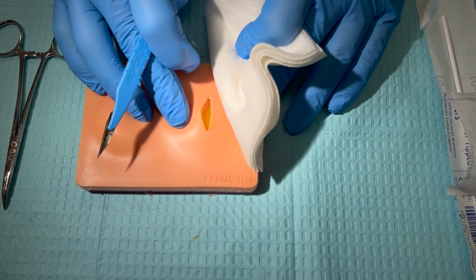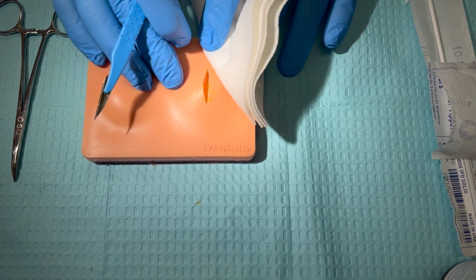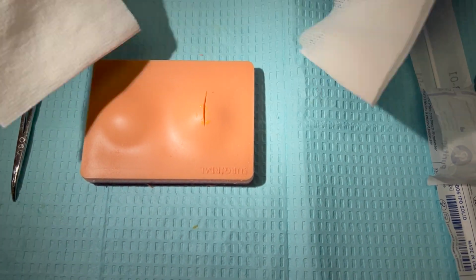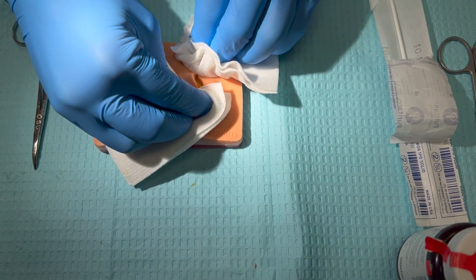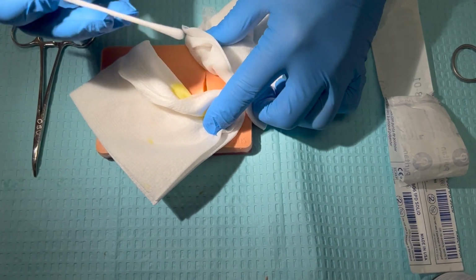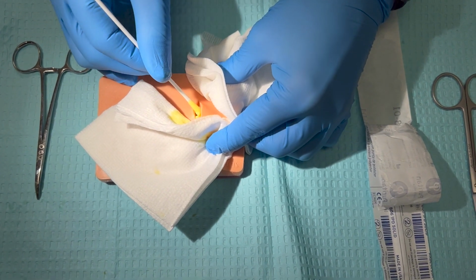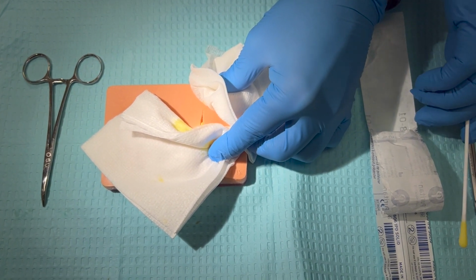This is an instance where at this point, nothing is draining from it. Typically, this will be ready to drain very rapidly. I'm going to go ahead and put my sharp away from me so that no injury is made. I'm going to initiate drainage using the gauze. As I get the initial amount of drainage out, this is the point that I'm going to go ahead and obtain a culture of that material by getting in there really well and making sure that I am rotating that swab and that it is covered. I'll hand this to my assistant who will put it in the appropriate container so that it can be sent out.